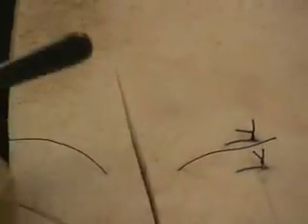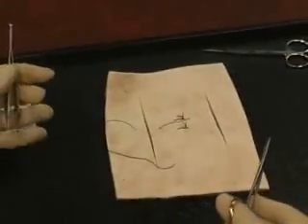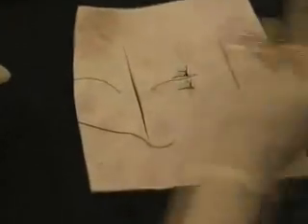We're going to pull this almost all the way through. We're going to load up backhand. And backhand is where our smiley face is pointing to the right side now. If you think about tennis, this is forehand and this is backhand. So we're going to load up so that we're actually going backhand. So this was forehand. We're going to load up to go backhand. And we're actually going to load up a little bit toward the point, maybe about halfway.